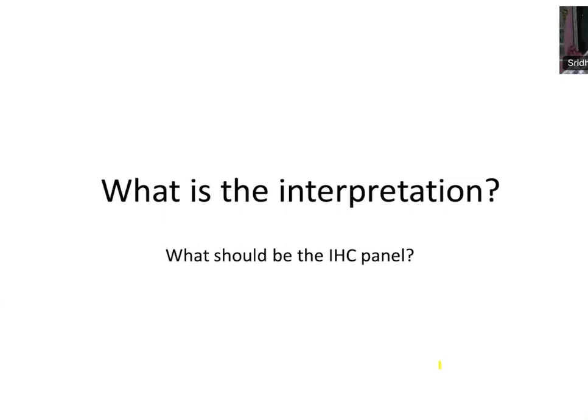Canalicular. So what is it? What's your interpretation? Sir, this is an ependymal tumor of posterior fossa origin. Yes, very good. Posterior fossa ependymoma. So what should be our IHC panel? Sir, H3K27me3. Very good. Whenever you get a posterior fossa ependymoma, what markers will you do? H3K27me3.